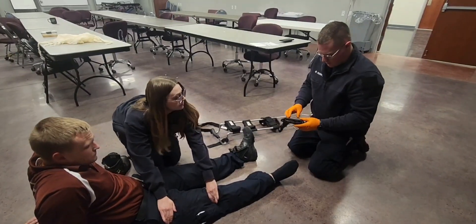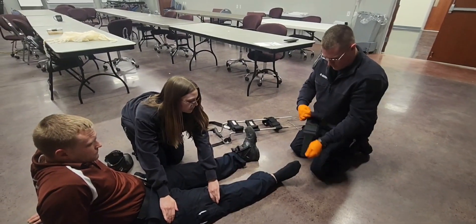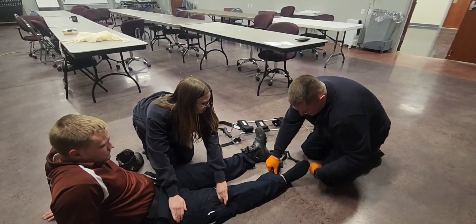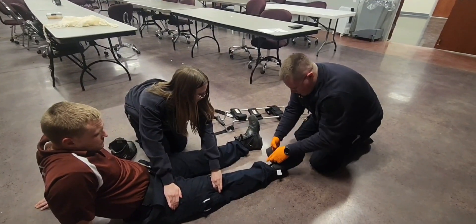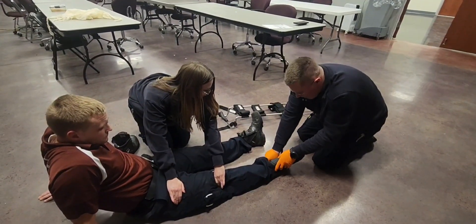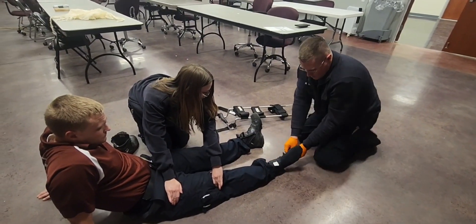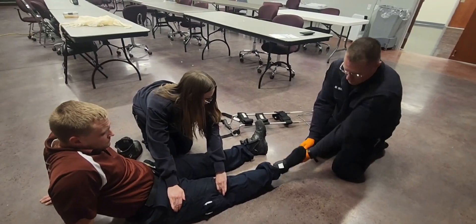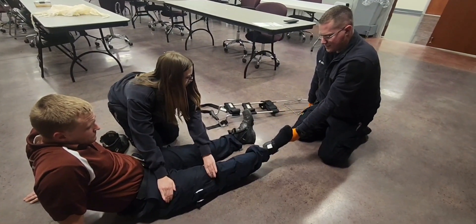Then I'm going to apply the ankle hitch. I'll slide this under his ankle. I'm going to pull manual traction by taking this metal ring — one up and out. Now that I have the manual traction, I'm going to pass that to my assistant.